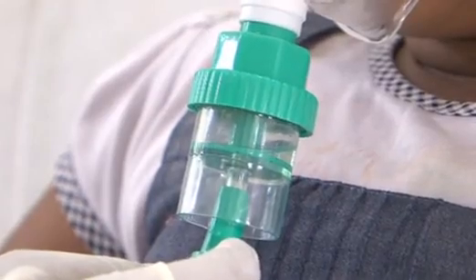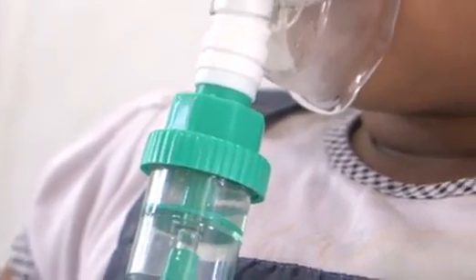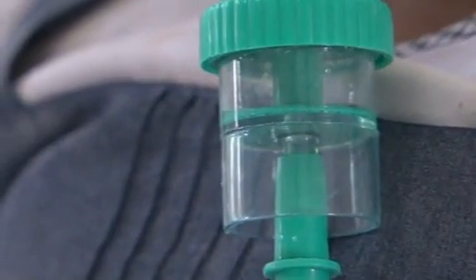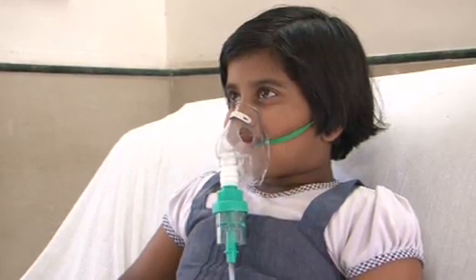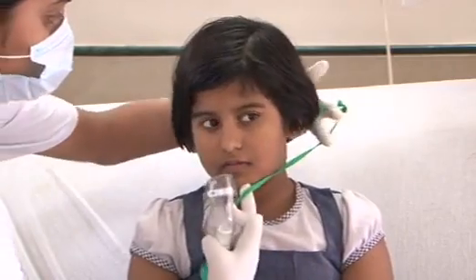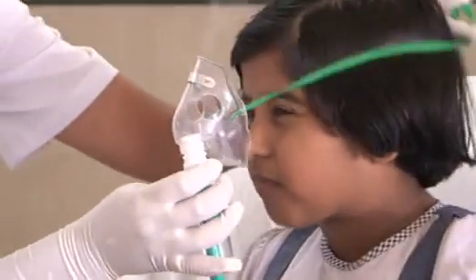Occasionally, tap the side of the nebulizer to help the solution drop to where it can be misted. Continue nebulization till the chamber is empty, approximately 5 to 10 minutes. Reassess patient after 20 minutes and repeat nebulization if required.